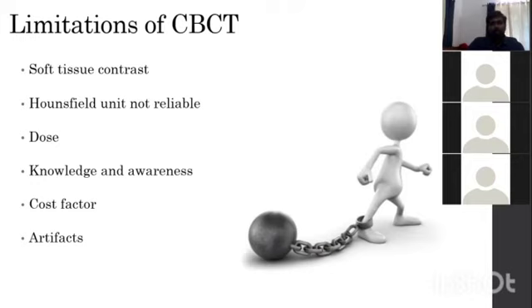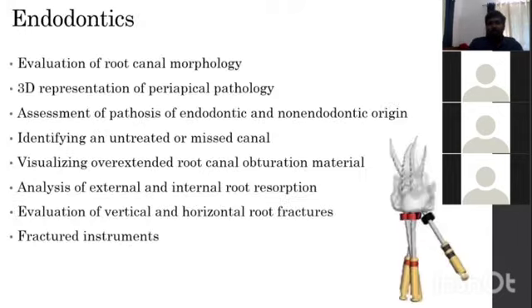And the dose of CBCT, when compared to other 2D dental imaging modalities, is a little bit higher. And one of the other limitations is that the knowledge and awareness among dental practitioners is very limited for CBCT. Then the cost factor: compared to other 2D images, the cost is a little bit higher. And artifacts, I already told you, are more in CBCT compared with other modalities.